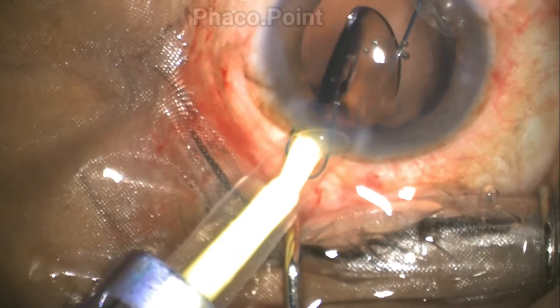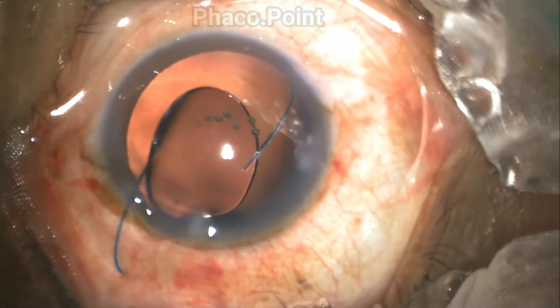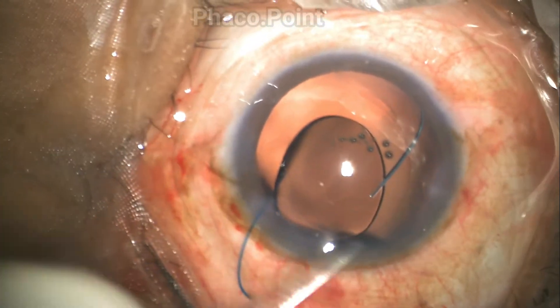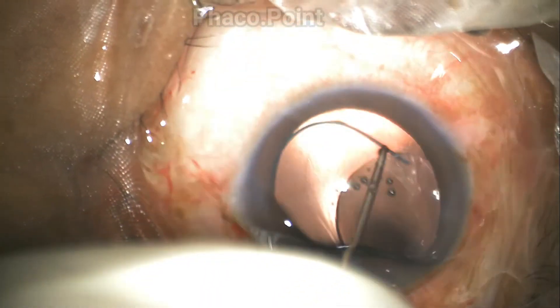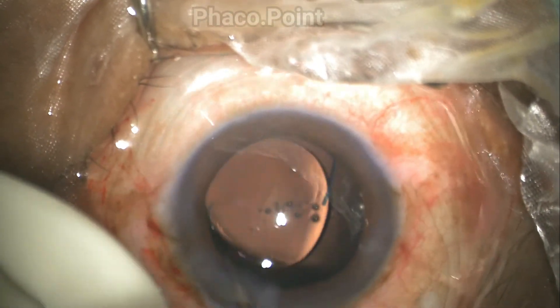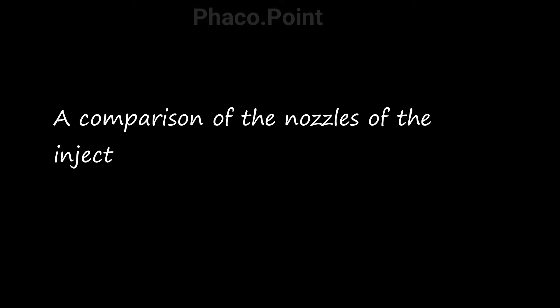The injector is then turned in a counterclockwise direction as the optic comes out. Very often the trailing haptic is outside the eye, but after introduction of a little viscoelastic, with the help of a Kuglen hook firmly hitching against the trailing haptic-optic junction and not letting go, a downward sweeping motion allows the rest of the IOL to be comfortably introduced into the capsular bag. The lens is then rotated horizontally, completing the insertion.